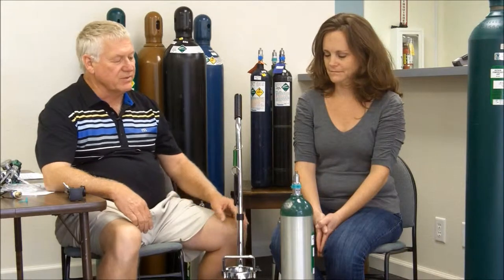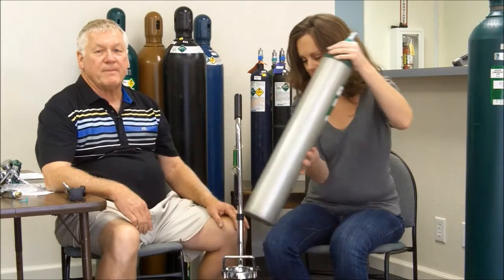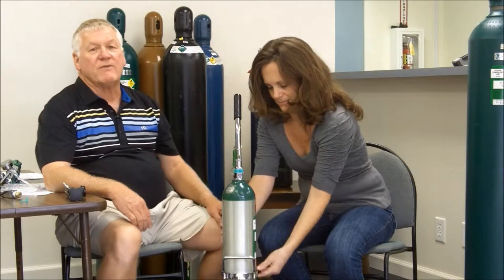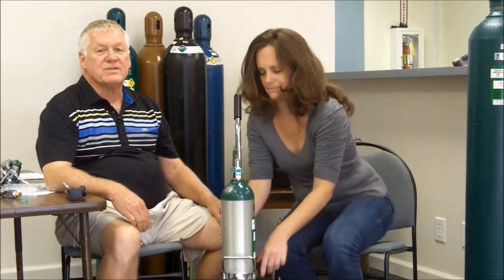I'm going to ask you to place a cylinder in the holder. You always want to be sure a cylinder is in a holder and secure, or laying flat. If you're going to store it in your office, you should store it in a cool place, well ventilated, 6 to 10 feet away from an open flame. Remember, oxygen is non-flammable but it does support combustion.